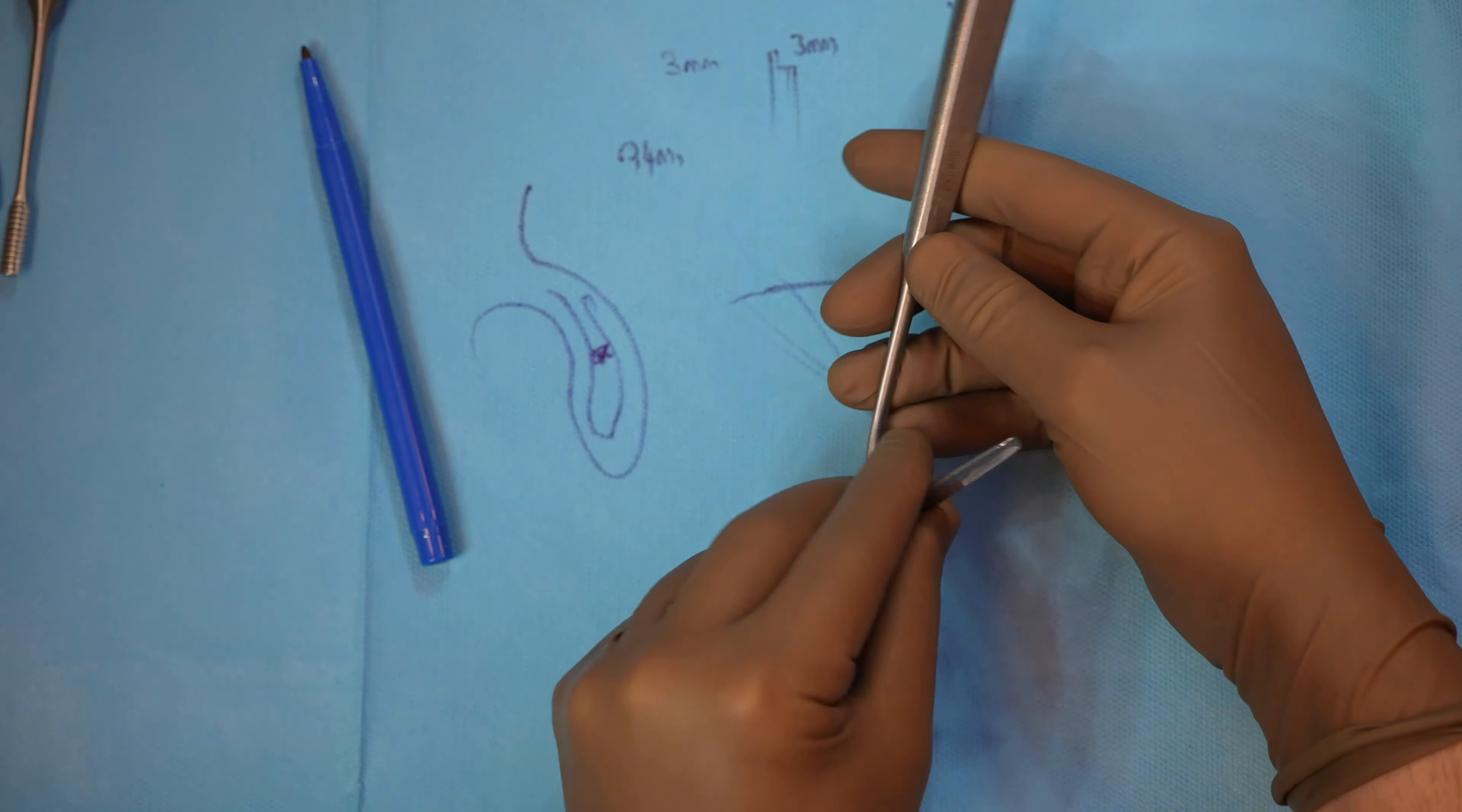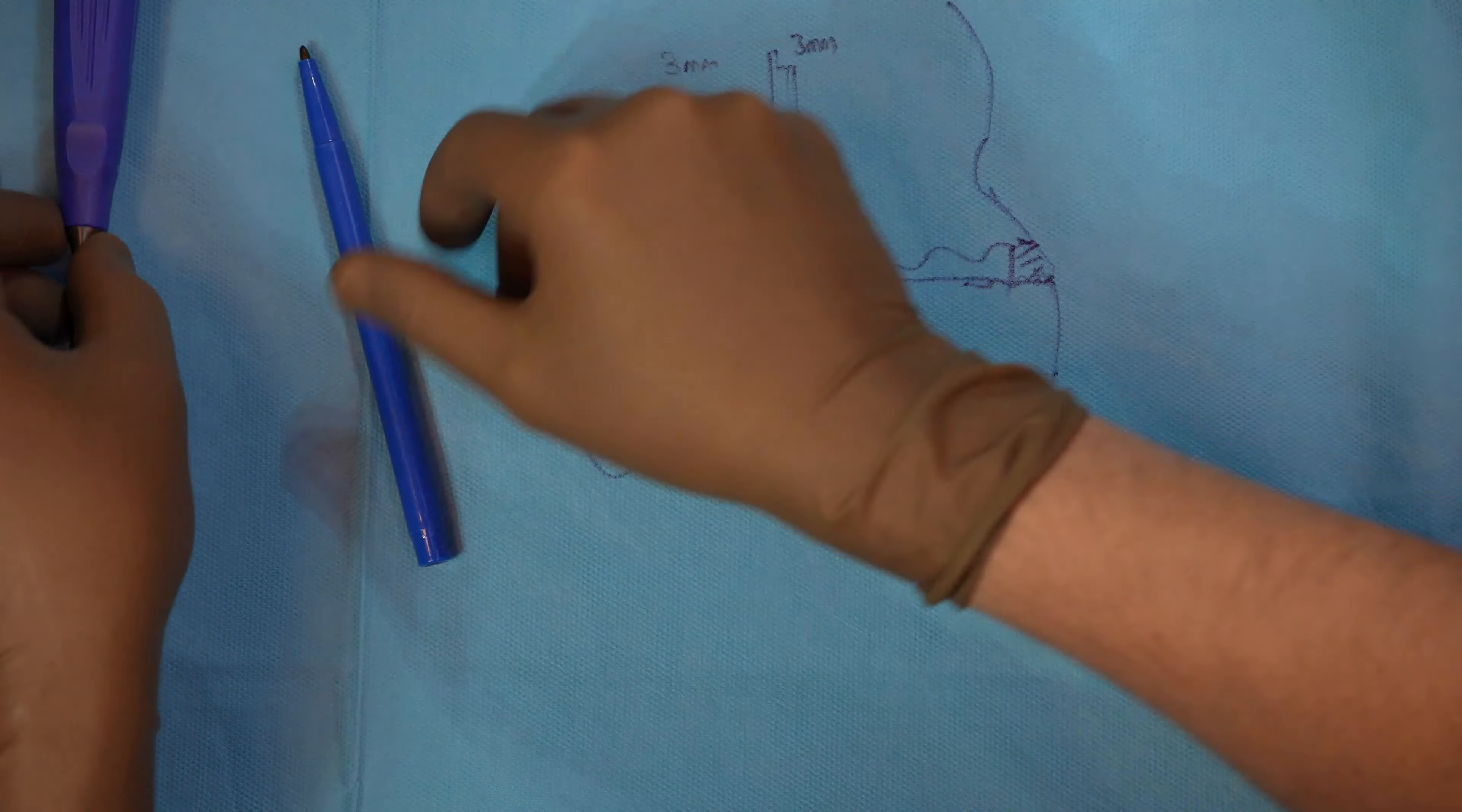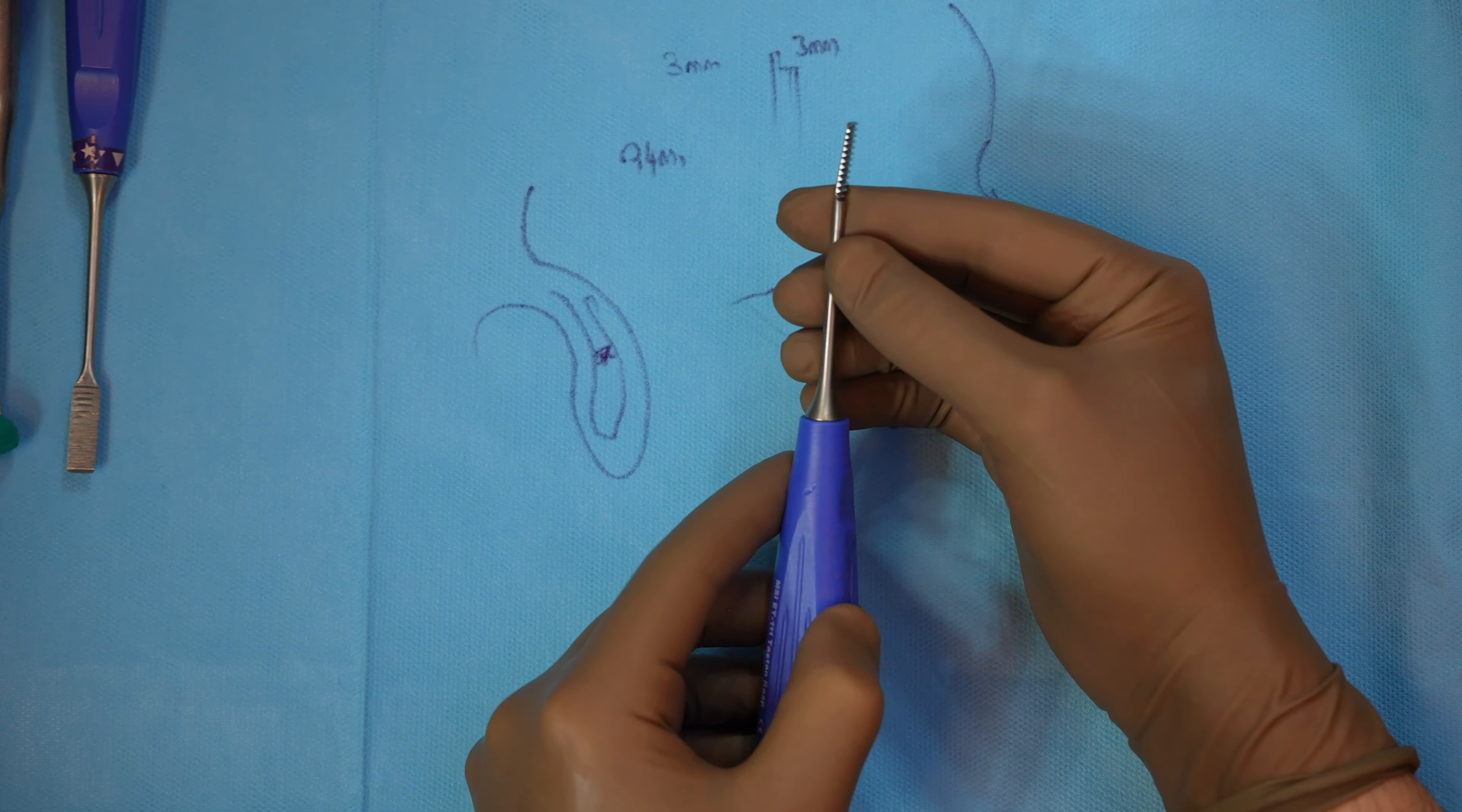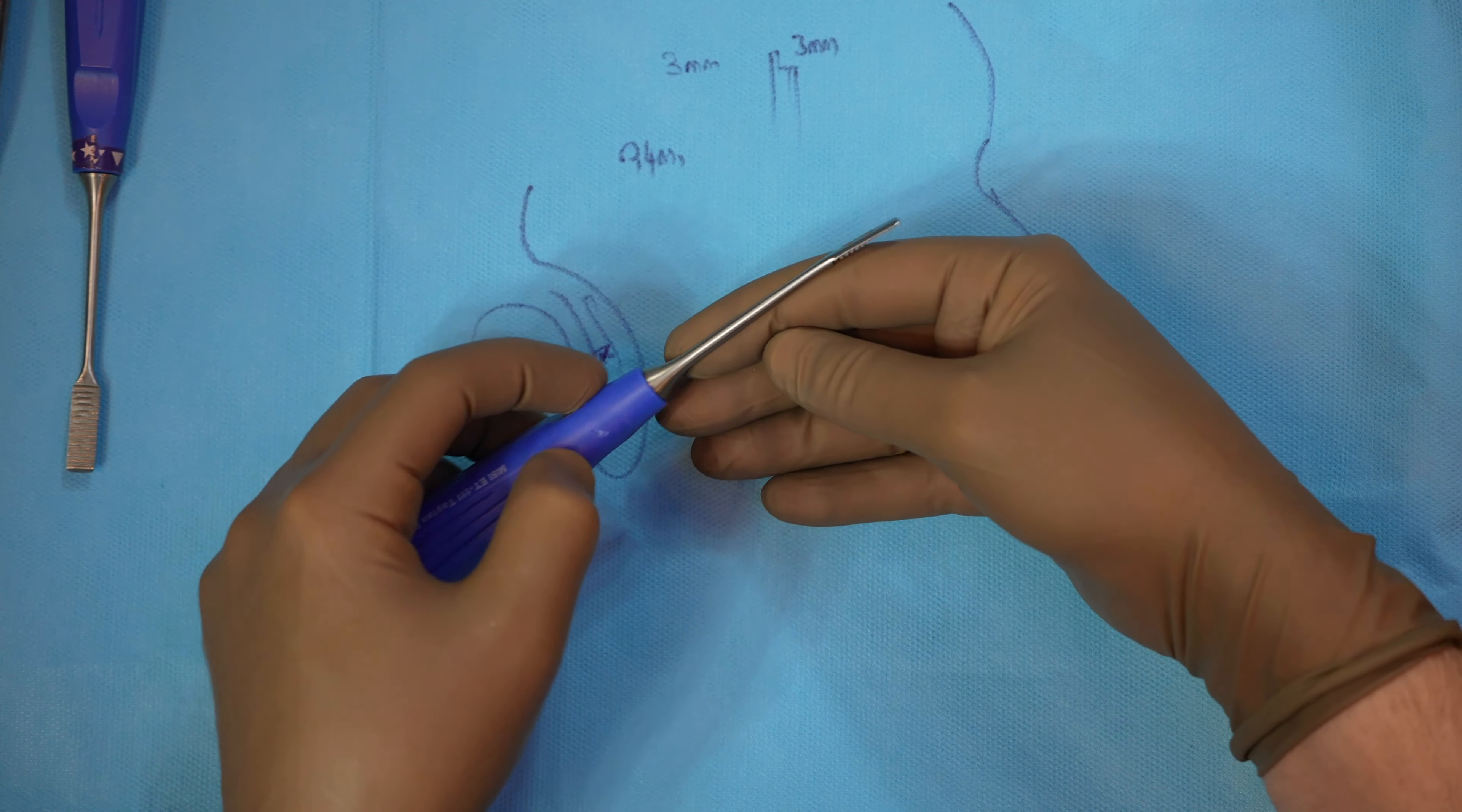This is Öskilab Ofric Retractor. It's really thin, so it's nice to use in close approach. Another one, this is lateral osteotomy rasp, Elen Tashtan design again. That neck angle is good to go to the lateral side.